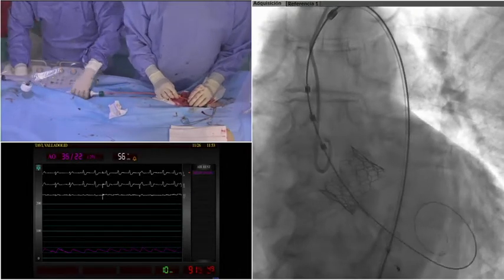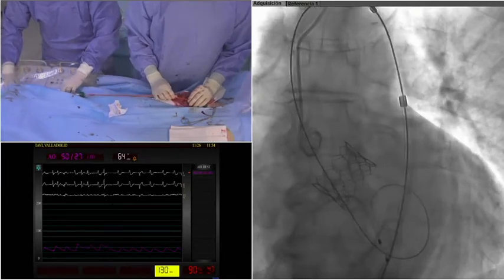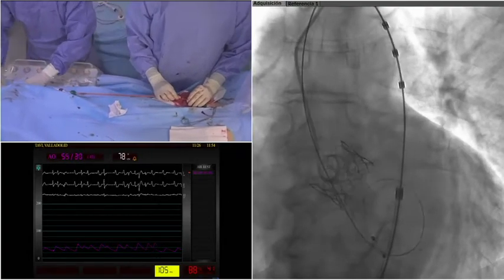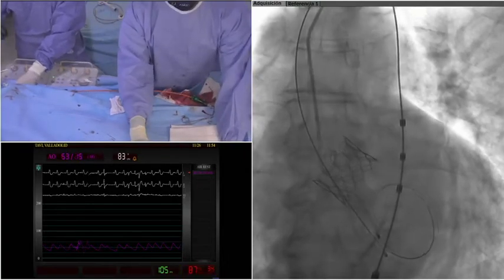We are going to administer noradrenaline to raise the pressures, but they are slowly going up. Vale. Espera que no se me salga la guía. Colócala si quieres. Okay. So pressures are going back slowly.